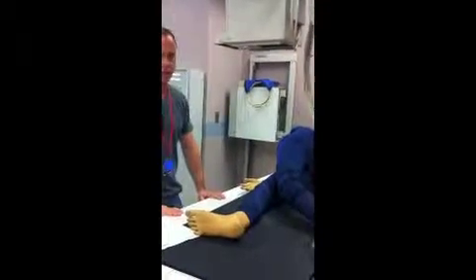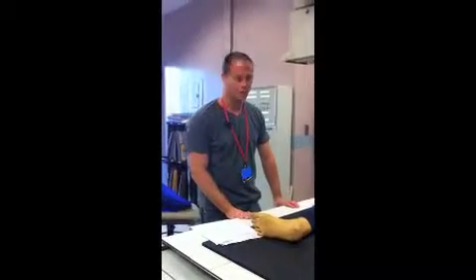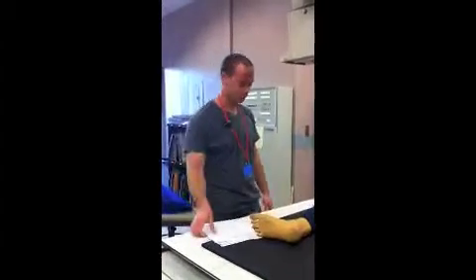Oh, and we are taking the image plates out after every exposure. I'm leaving it in here for the purpose of the video, for brevity.